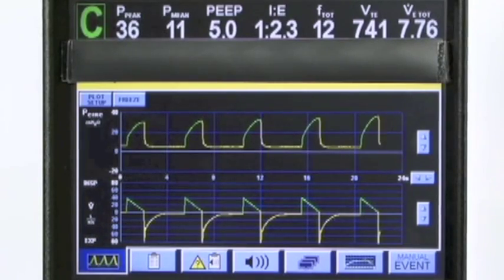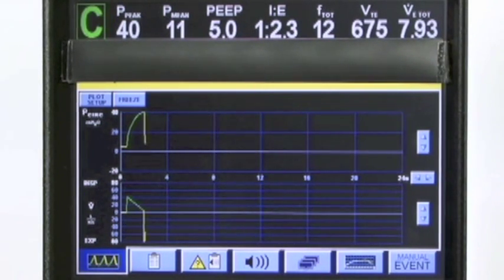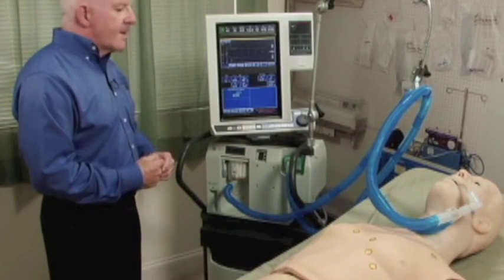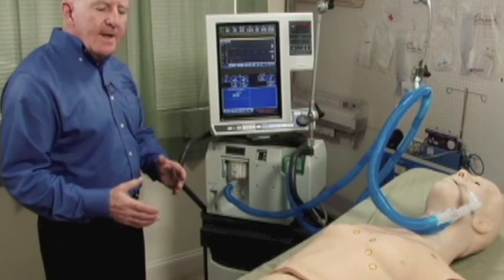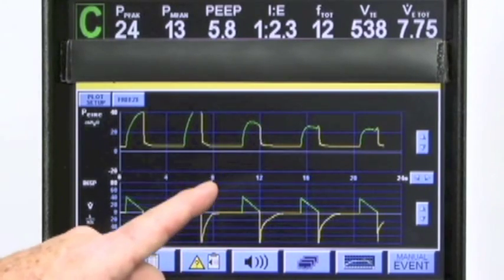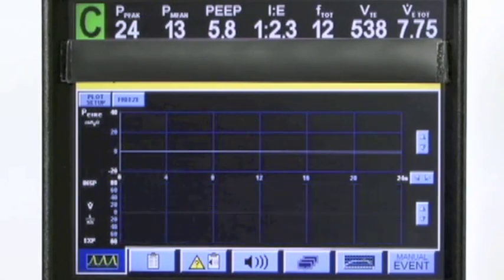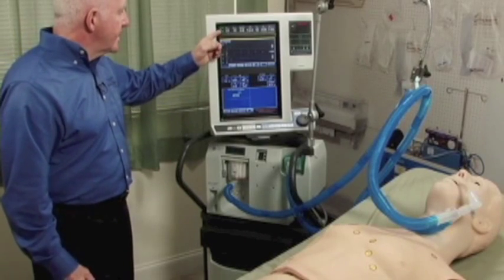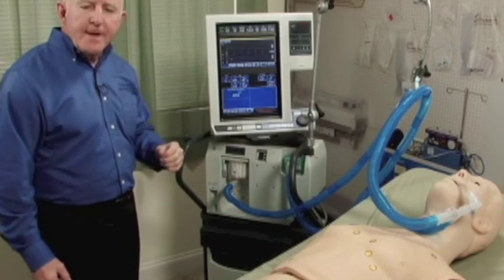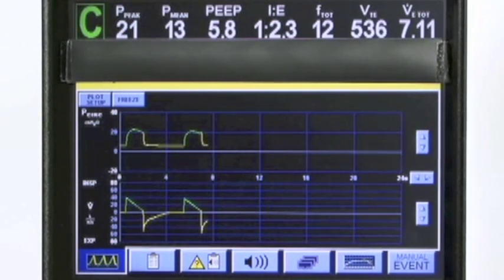Now, if we make the lung looser or increase the numeric compliance value, once again while the mannequin is fully operational, maintaining complete realism while HAL is ventilating above his set PEEP level, we see a return to lower peak pressures and very realistic respiratory graphics.